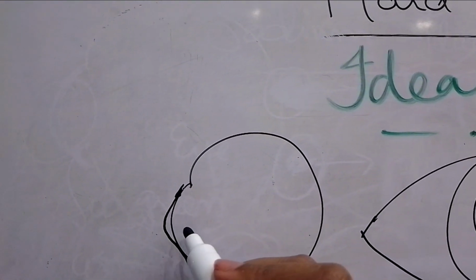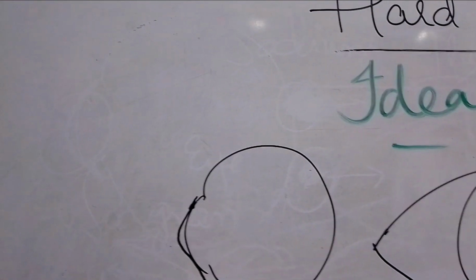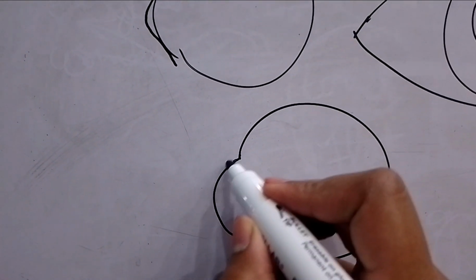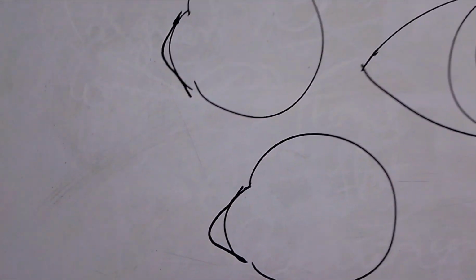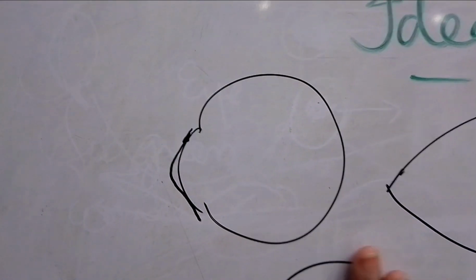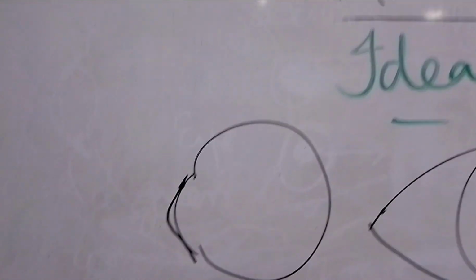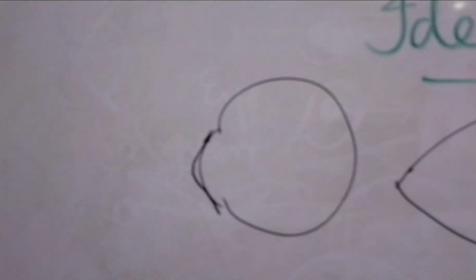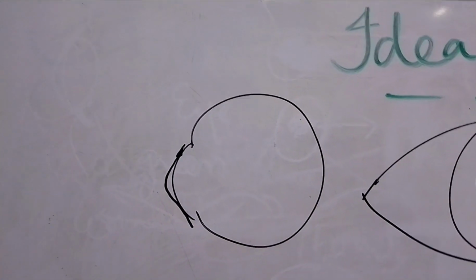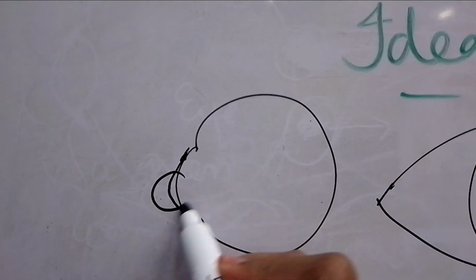It's not that much. More steepness means that it's actually like that. Okay, so you can see the difference. I have drawn the image, that is why it may appear more steepened, but what I mean is that there should not be much steepness nor much flatness. Okay, so there should be a little steepness in the center or in the apical region.